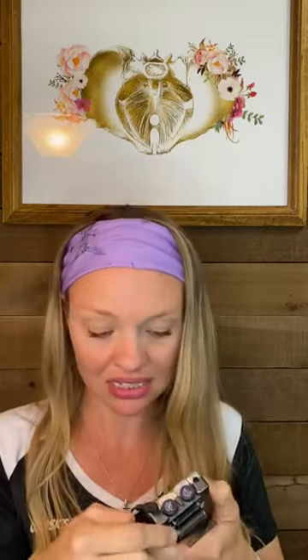So then you're gonna turn on the dial and you're gonna go real slow, because it only goes up to 8. And usually people feel it at 3, and then they can't stand it any longer at 4. This is a really sensitive space, so be kind and gentle to yourself, okay? Because I cannot feel what you feel. And you're gonna go all the way up, and you'll start to feel it around 3, and you'll be like, oh man, that feels weird. And you're gonna go all the way up until you feel that muscle activate, and it's gonna pull your anus up inside your body. And that's the Kegel, and that's what we're going for.